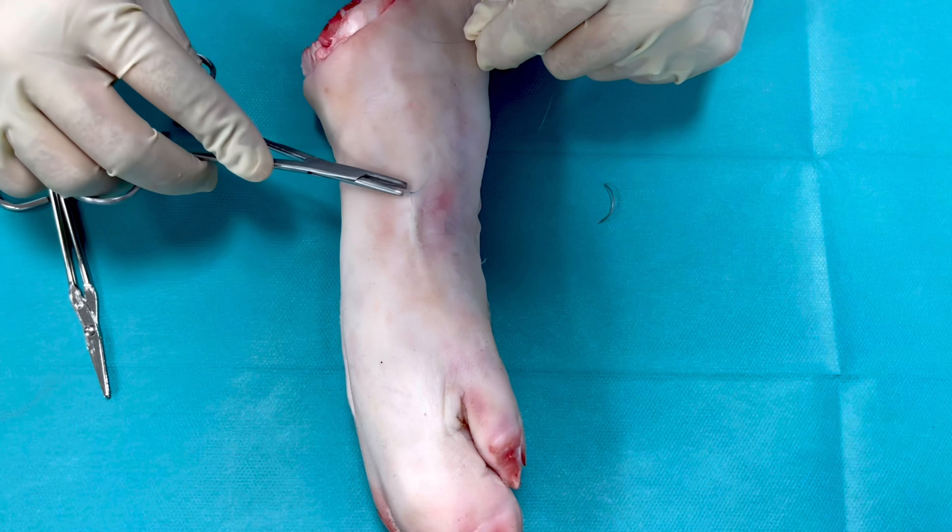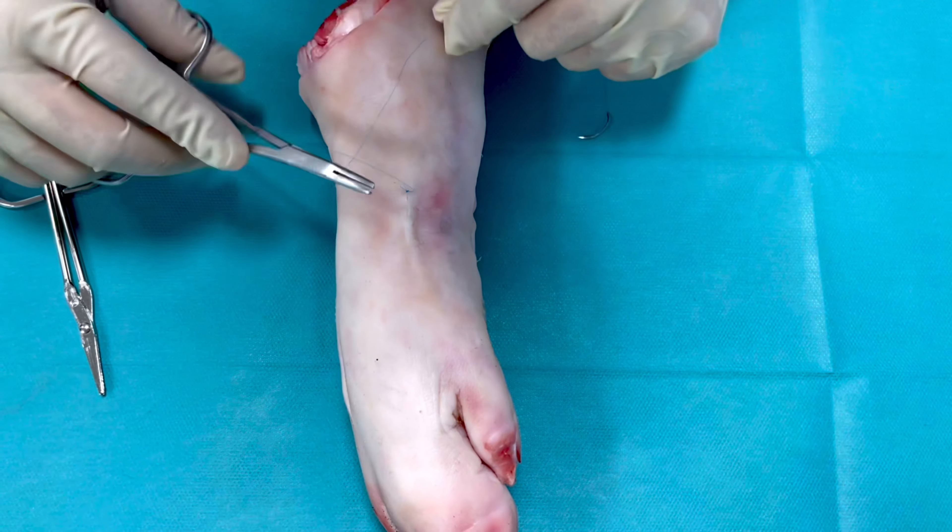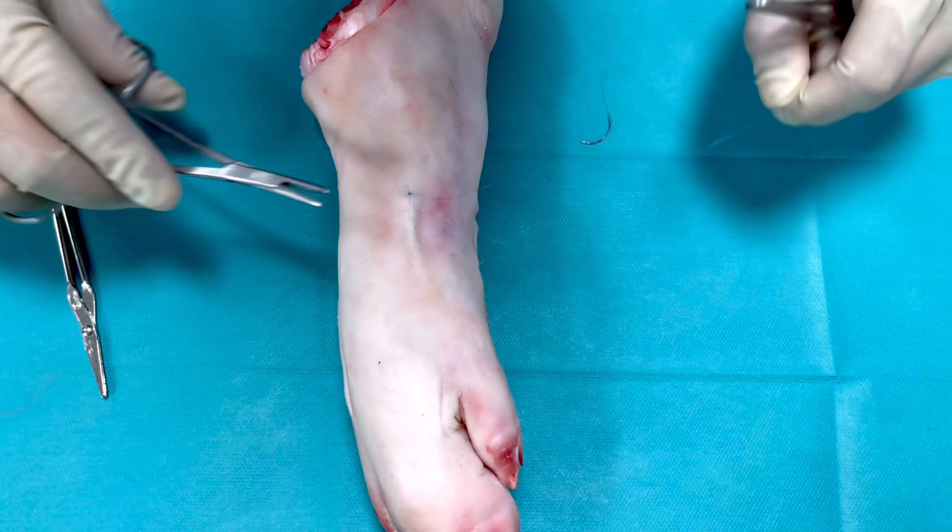Hello there. This video will describe the subcuticular suture, which is basically a buried dermal continuous suture.